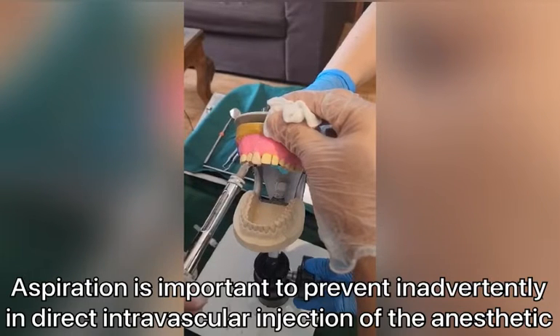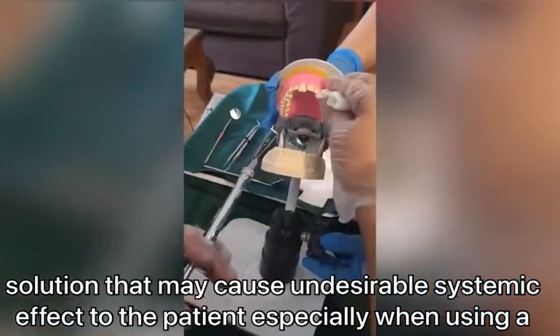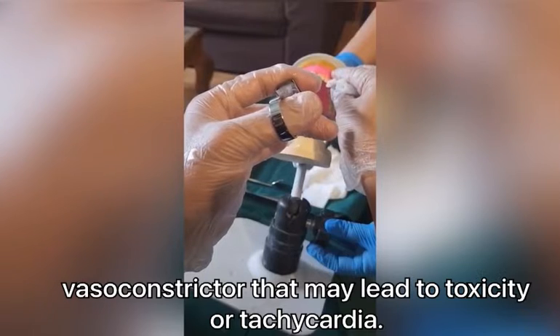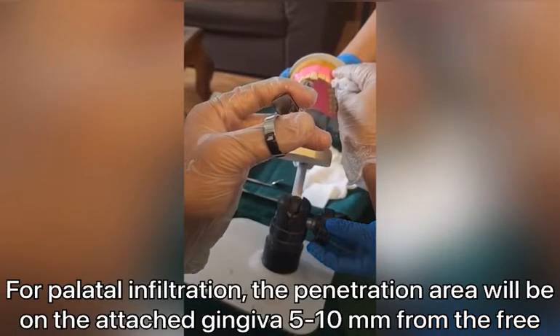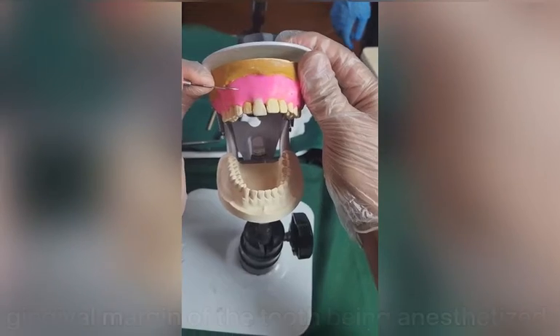Aspiration is important to prevent inadvertent direct intravascular injection of the anesthetic solution that may cause undesirable systemic effect to the patient, especially when using a vasoconstrictor that may lead to toxicity or tachycardia. For a palatal infiltration, the penetration area will be on the attached gingiva 5 to 10 millimeters from the free gingival margin of the tooth being anesthetized.